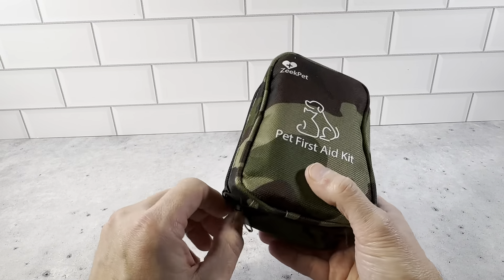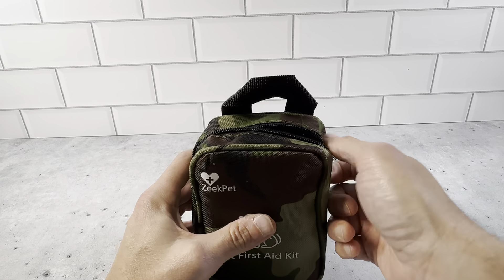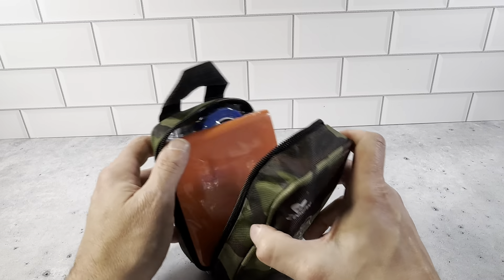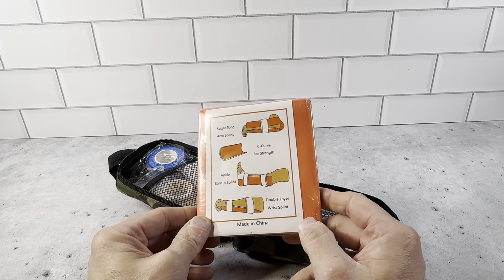It's put together really nicely when you open it up. It's got pretty much everything you could think of for pets and any trouble they might run into. We'll just go through everything right here. It's got, I believe, something like 47 different pieces.